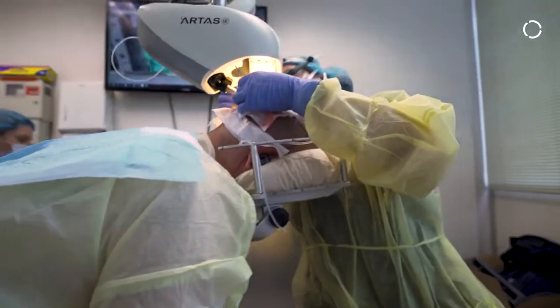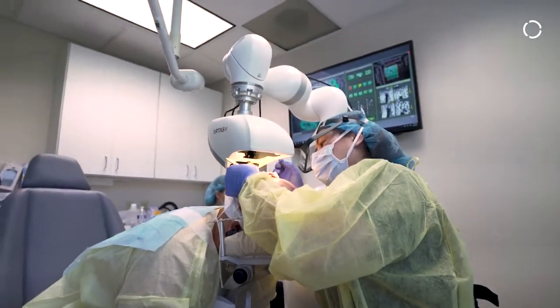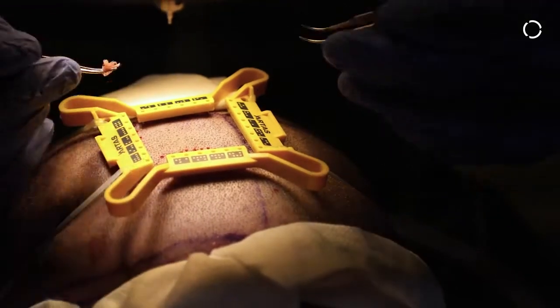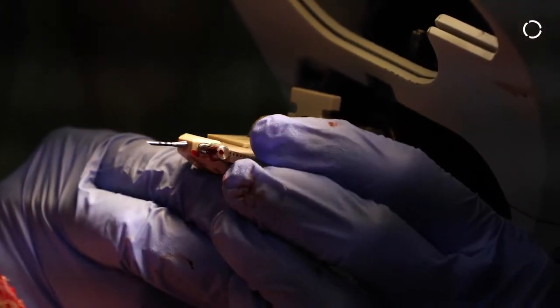Hair restoration is a very particular aesthetic procedure. You're basically transplanting an organ, which is the grafts, but you're doing it 1,000 times, 2,000 times. A graft is really tiny, it's only a few millimeters in length, and it's a very delicate structure. The first graft you extract and implant has to be just as accurate and as precise as the 2,000th graft that you're implanting, right?